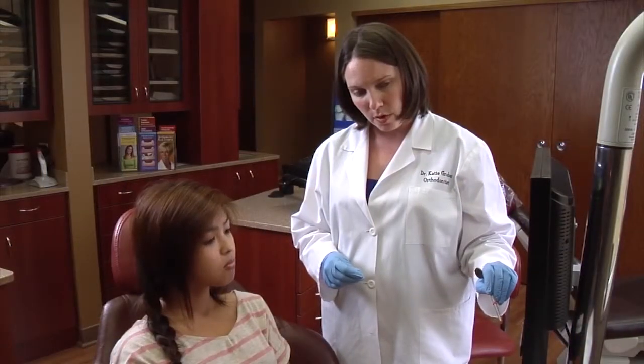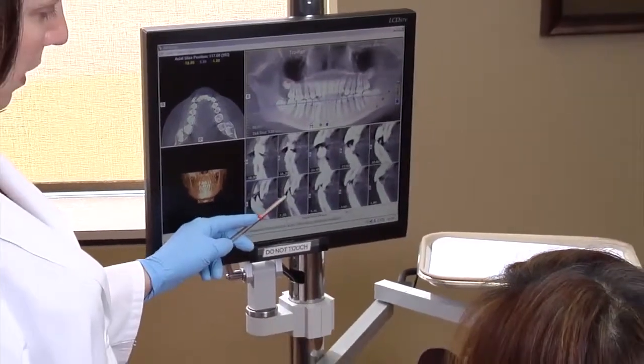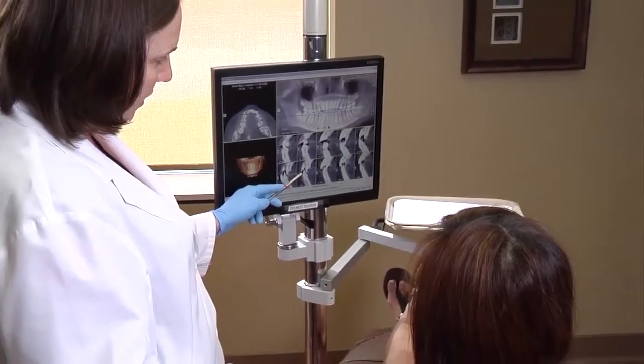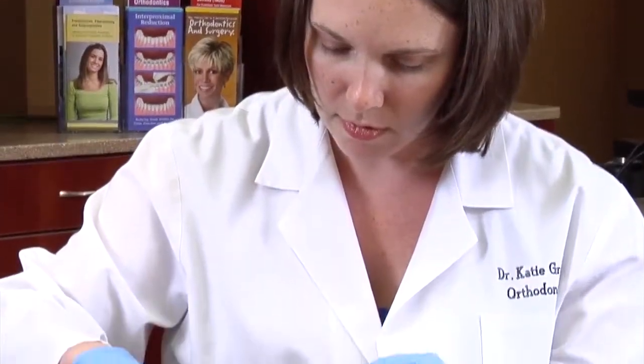Finally, TADs may be used as part of an orthodontic treatment program, which will prevent more costly and intrusive dental work. The patient may return for orthodontic brace activations and use of the TAD almost immediately.